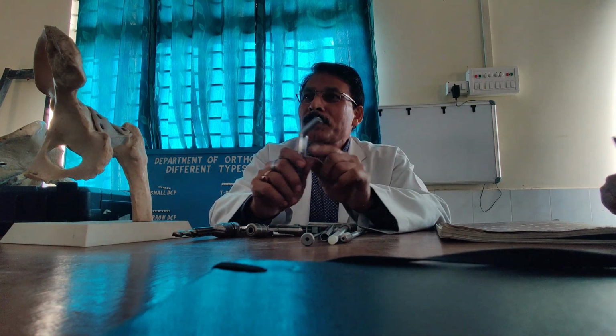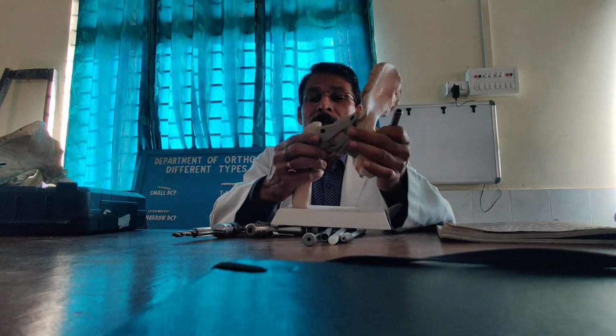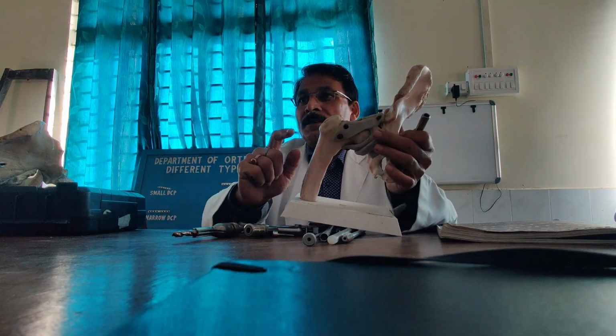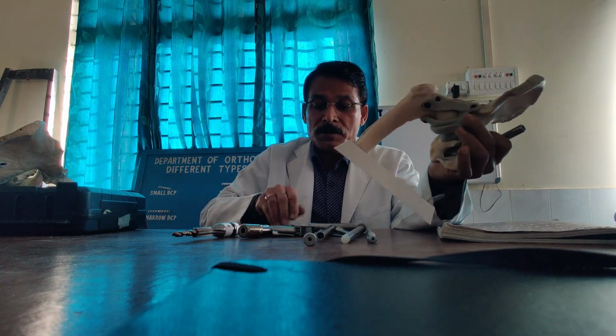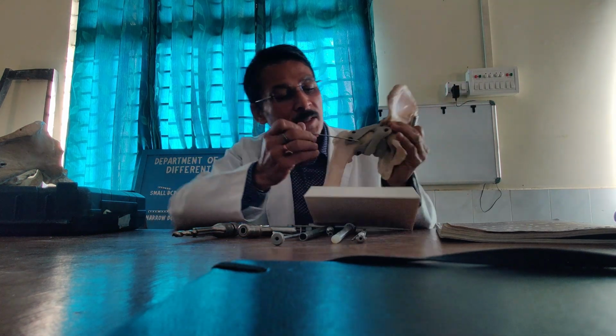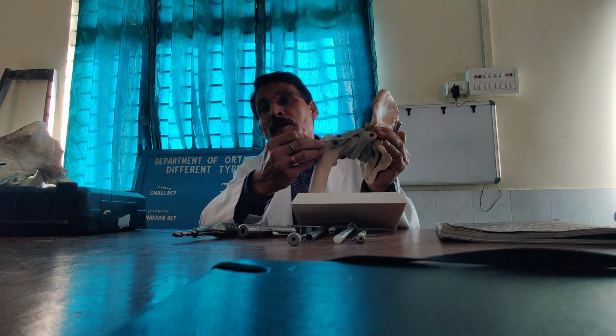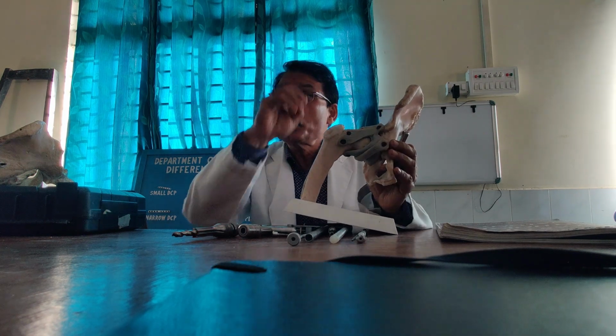Rather, we are selecting 150 degree, most of the time, but not always true, because the idea behind is that I am supposed to place the guide wire in the center. So in the center means, supposing this is your neck, this is the center. So my idea is that I have to place the plate in the center. Center in both AP and lateral view. So it is supposed to be bull's eye.